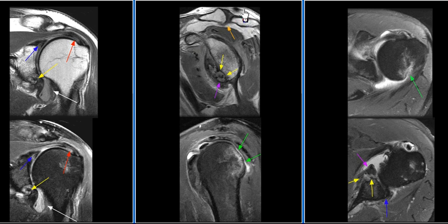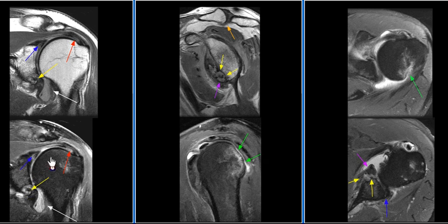Mild hypertrophic changes are seen in the acromioclavicular joint with a type 2 acromion. MR findings are consistent with a Bony Bankart lesion associated with a Hill-Sachs lesion and labral tear.